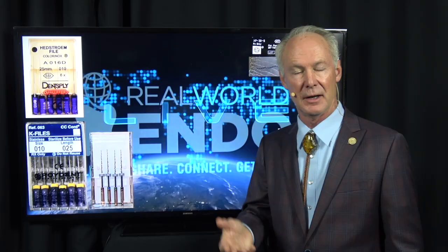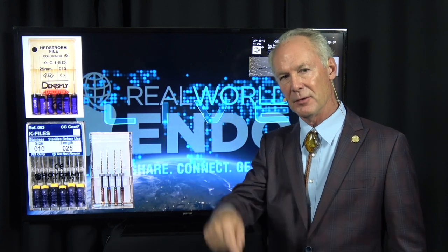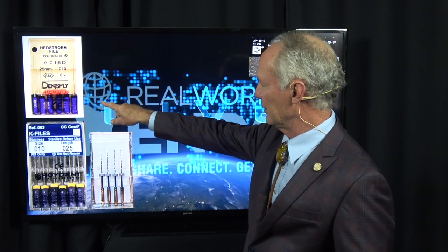That way, if it's cleaned and irrigated, if you should separate a file, it's not the end of the world, and you probably don't have to have somebody remove that file. There's some risk to the tooth if you remove a separated file, any of perforation. And so if you've cleaned it out and irrigated it real well, this separated file becomes like a silver point that was the only thing dentists had to fill canals with years ago. I'm not suggesting you become sloppy, and you don't want to put pressure with the rotary files, but if it happened, it's not life and death. If you've cleaned that canal out to depth with a hand file and irrigated it well before you have a separated rotary file.